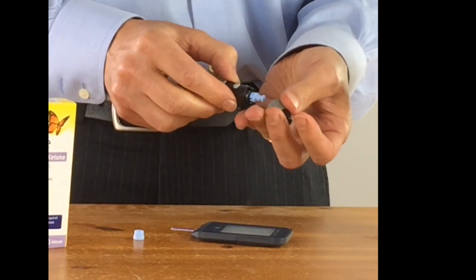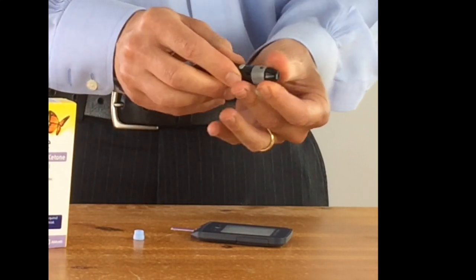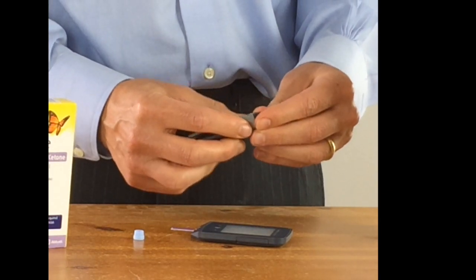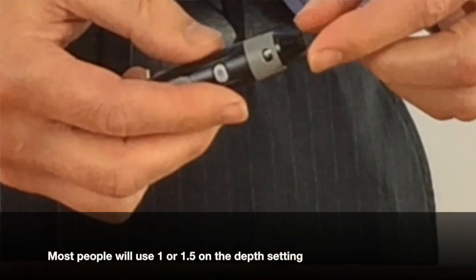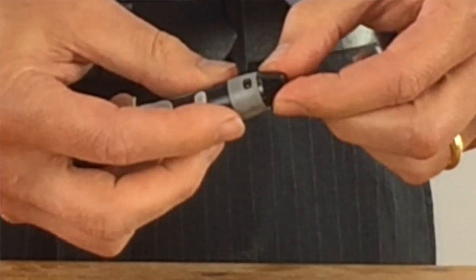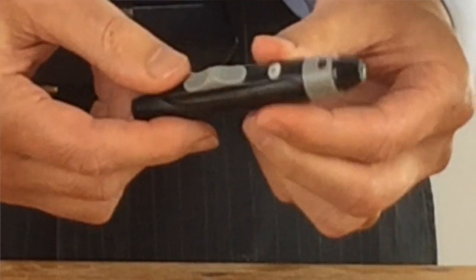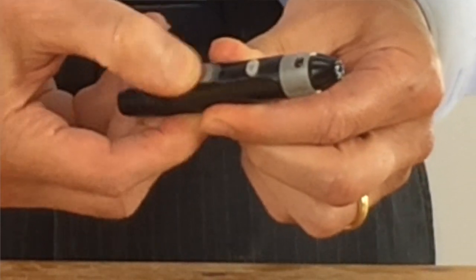You put the cover on and then set the numbers according to how thick your skin is. For me it's usually about one and a half, and you adjust it by twisting this top black knob. You arm the device by pulling down. You'll hear a click.